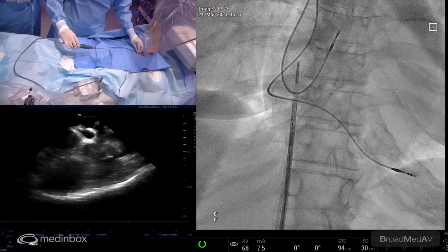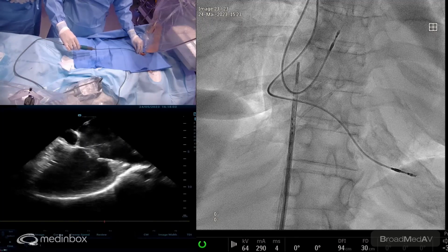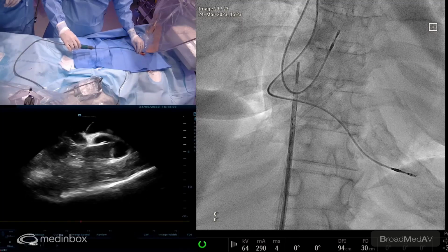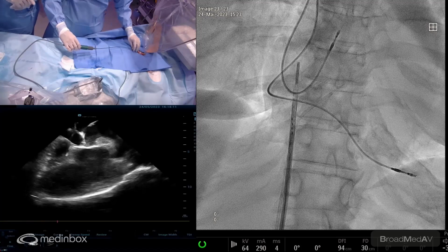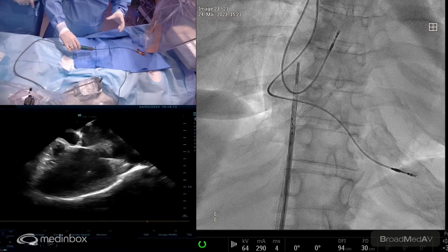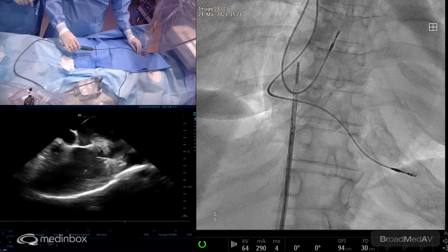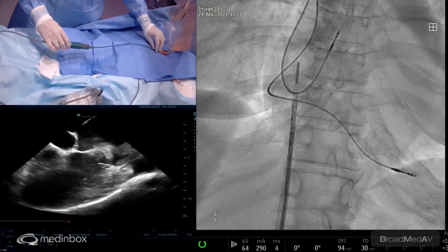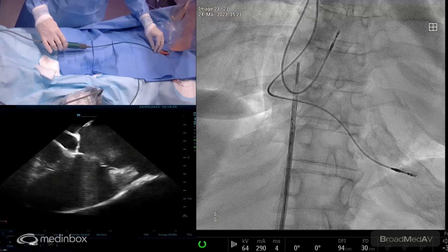By doing that, we should see more left ventricle, and this is the case. You see well now the left ventricle. You also see well the mitral valve, the coronary sinus around 9 o'clock, and the left atrium. Can we zoom in now, just to focus on the septum? Yeah, sure. Go.